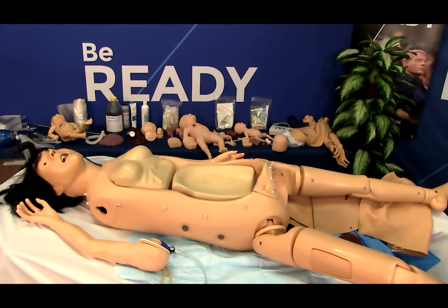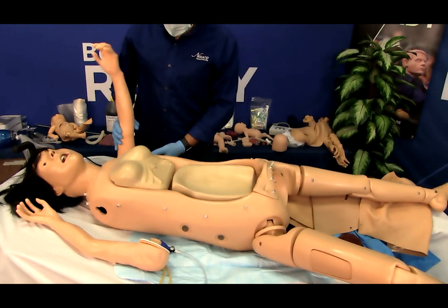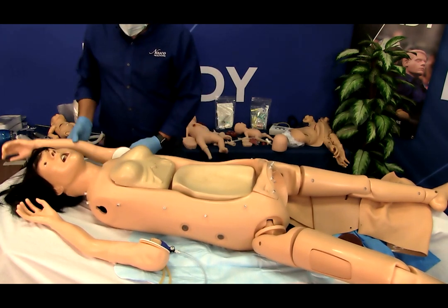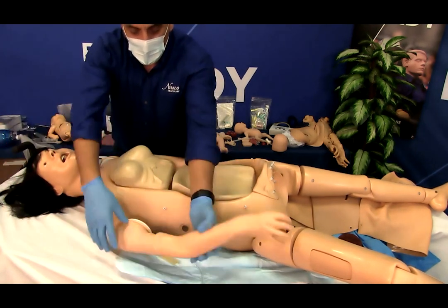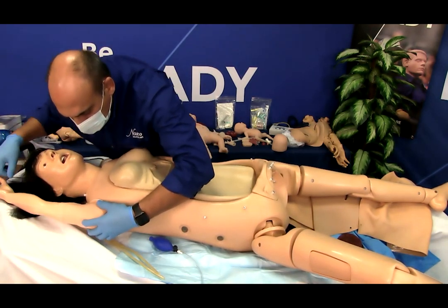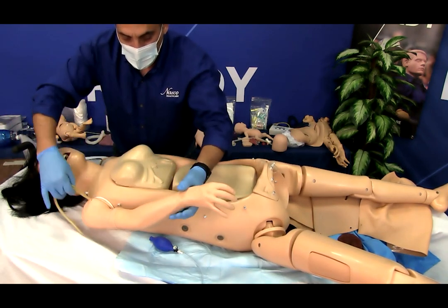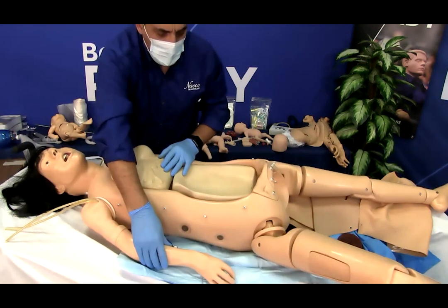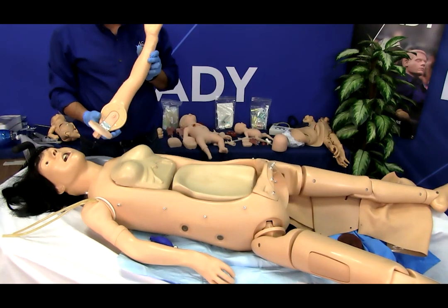All models are packaged with some light assembly required. This is to ensure that damage does not occur during shipping. To attach the arms, push the arm toward the shoulder of the mannequin with the keyhole aligned. And with the keyholes aligned, bring the arm to a normal position. These instructions may be followed to install both the plain arms included with the basic, complete, or advanced Lucy, and the blood pressure and IV arms that are included with the advanced version only.